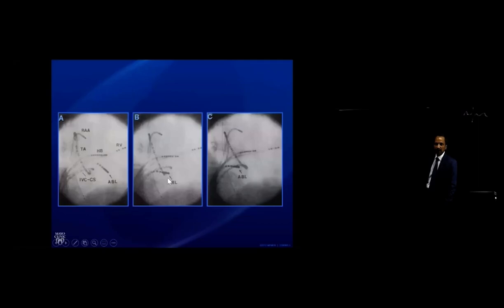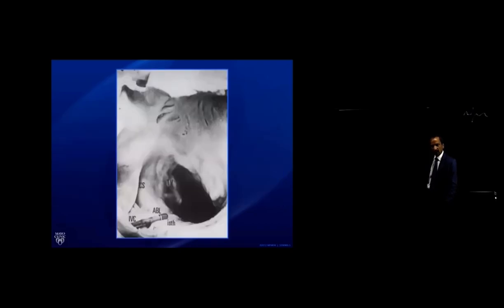Most important thing with any type of reentrant tachycardia when we are trying to do anatomic ablation is to not only understand the anatomic obstacles that were connecting with the flutter line, but what's in between. What I mean by that is if we take a simplistic picture in our mind, tricuspid valve, IVC, and it's a line, literally a line through flat terrain, it causes a lot of difficulty when we're not quite getting rid of the flutter.